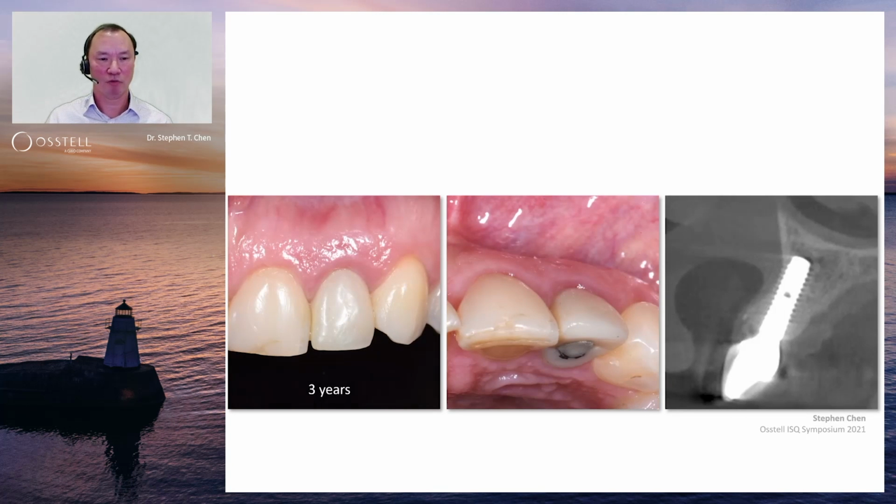And then the 3-year outcome. So a very nice outcome for this patient, maintenance of good soft tissue form, both from the facial aspect, and when you look at the middle image from the occlusal aspect, maintenance of good contour of the ridge, and the CBCT control taken at 3 years confirms that we have reconstructed a thick facial bone wall.